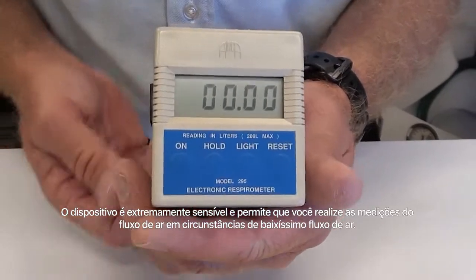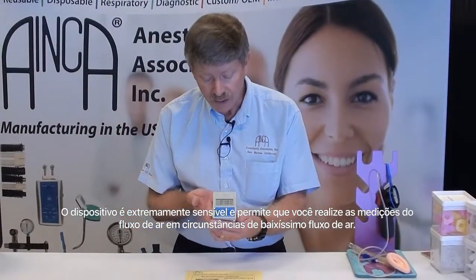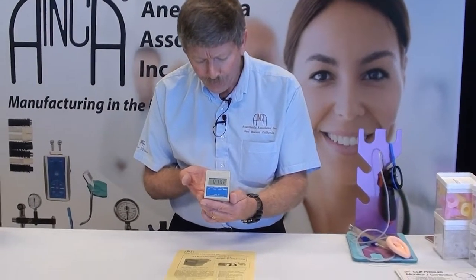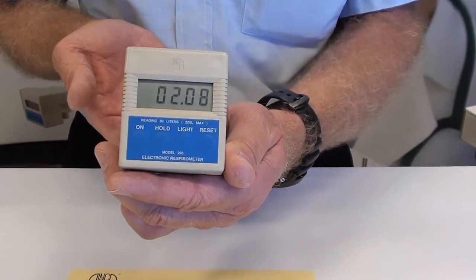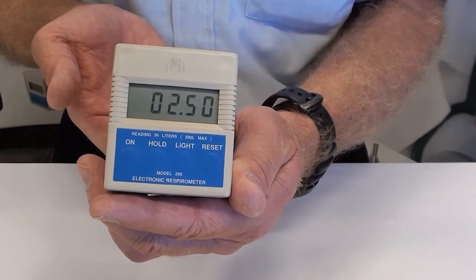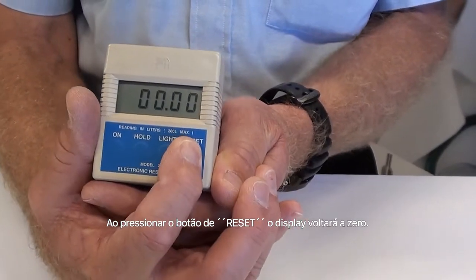The device is very sensitive and allows you to measure airflow even under very low flow conditions. You can see the display changing. When you press the reset button, the display will go back to zero.